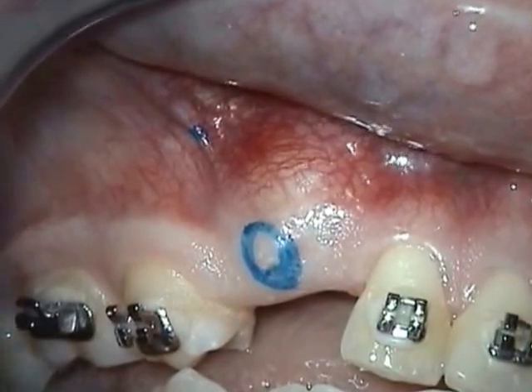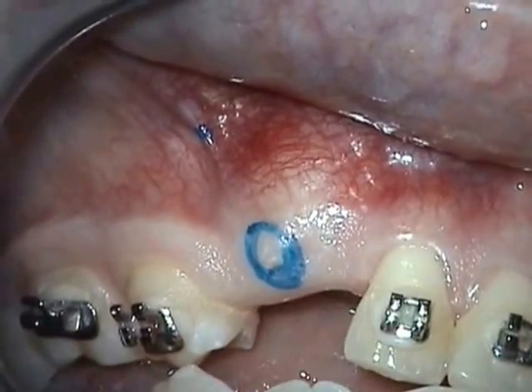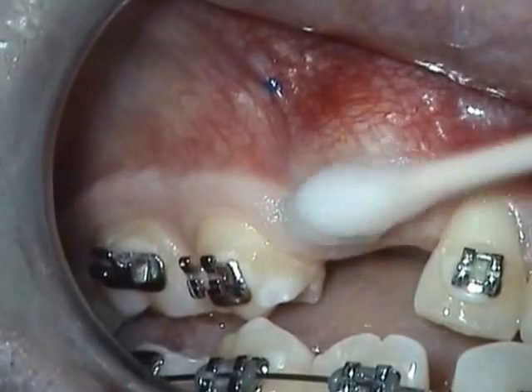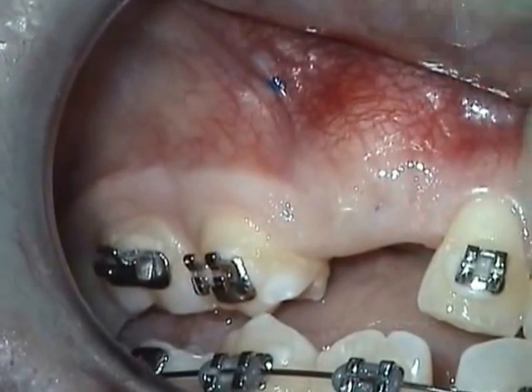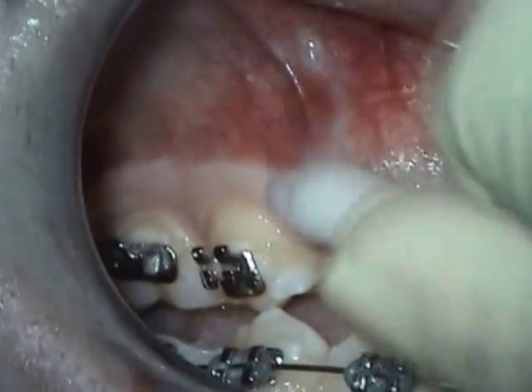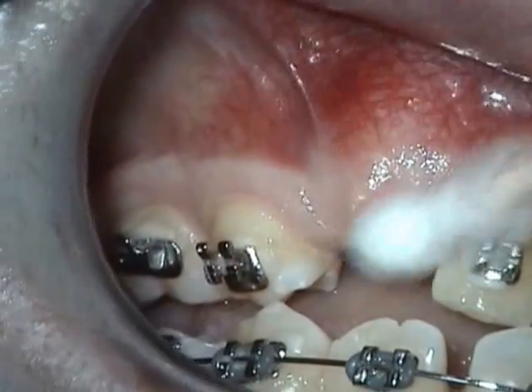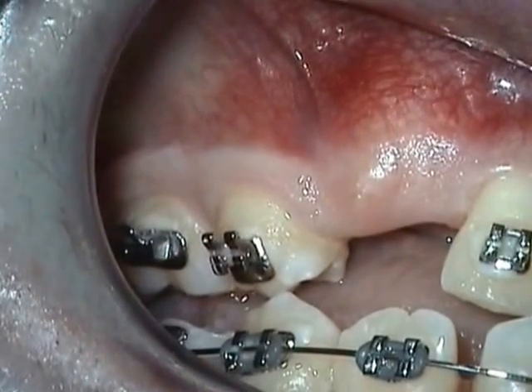Mark the area to be excised before you commence your incision. Remove the marks as these will absorb your laser energy and you do not want that. Make sure that the area is well anaesthetised using a topical anaesthetic — this is usually more than adequate.